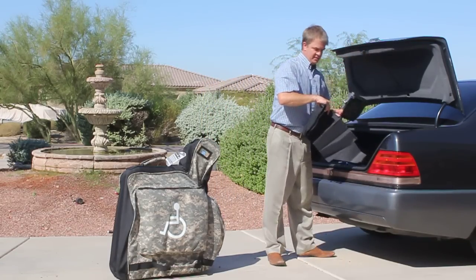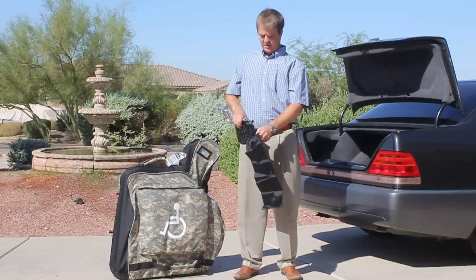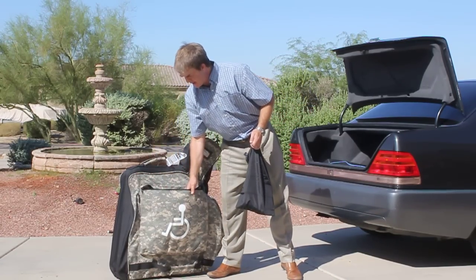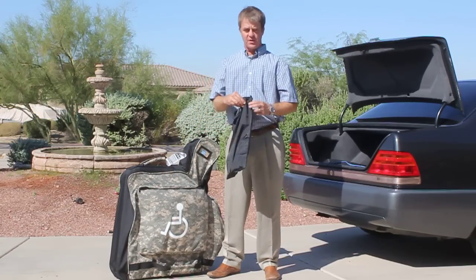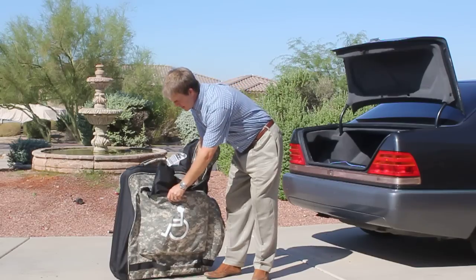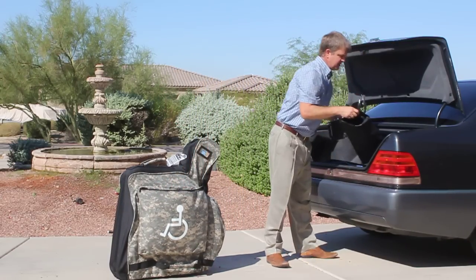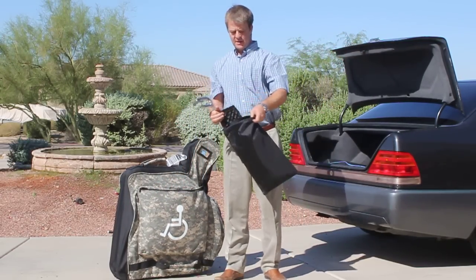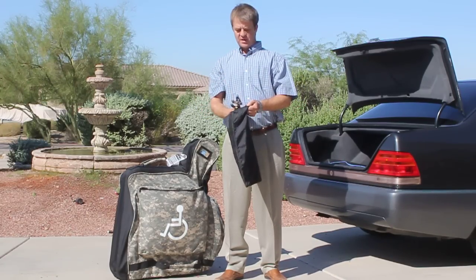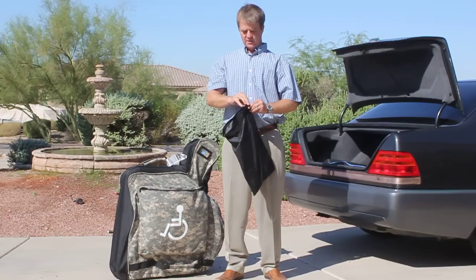In addition, you have your leg risers. This is for airline travel only. Your leg risers have their own pouches. They go in this padded pouch, which is perfectly set up just for the leg risers. First leg riser goes in the pouch, goes all the way down the bottom. Second leg riser pouch has Velcro on the top of it so that the leg risers don't slam down on top of each other. Zip the pouch up.